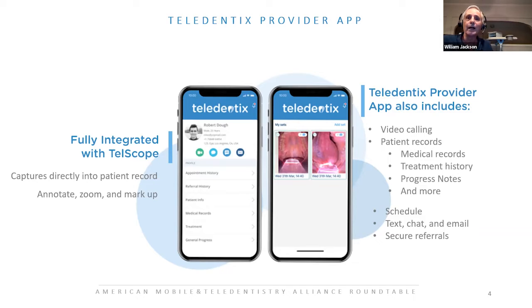We had early on as a company assumed that intraoral cameras were going to be the solution. We built a lot of our application to support intraoral cameras out in the field. This is so much better. And I'm saying that as much professionally as I am just having worked with other people that use this. It's so much easier to use than an intraoral camera. And I'll talk about it in a few seconds, but it's also something that a non-professional can use quite easily.